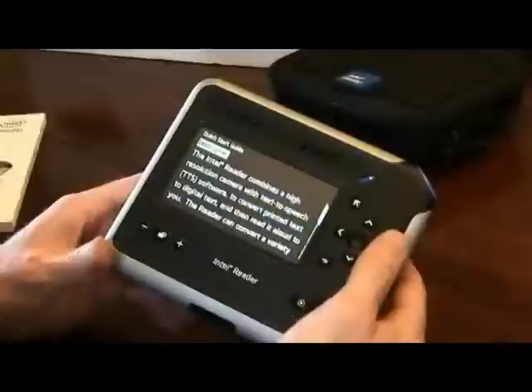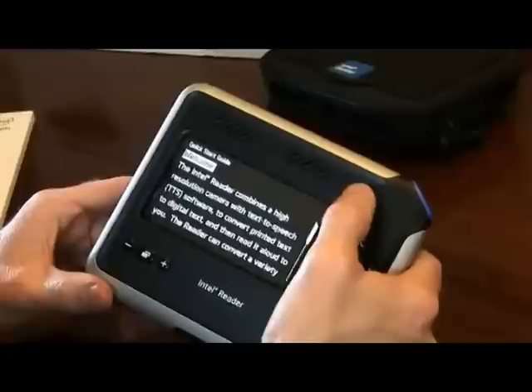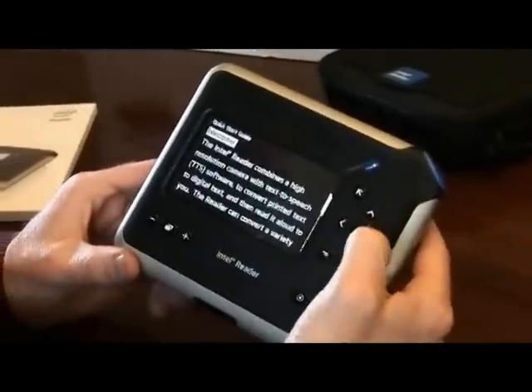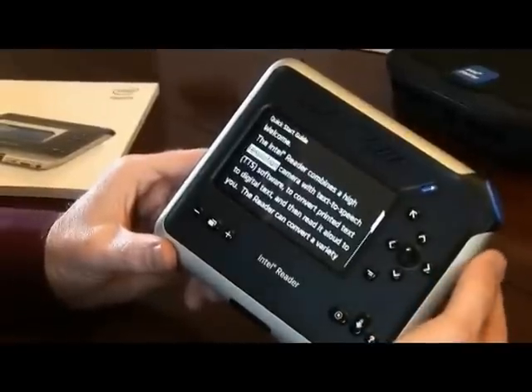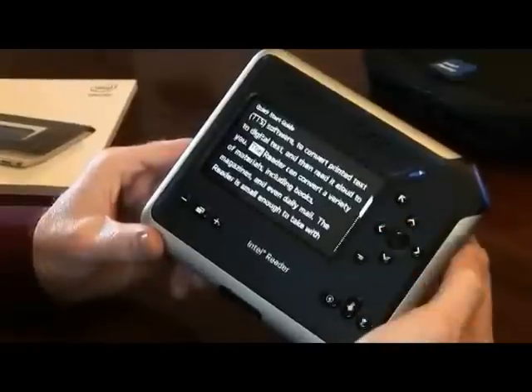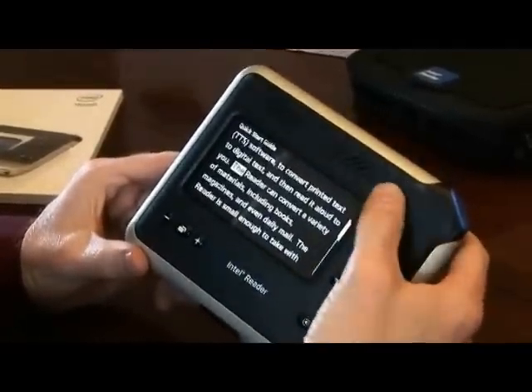So let's enter the help menu. You should start on the word welcome. To read, you either press the play button or the select button here. The Intel registered reader combines a high resolution camera. To pause, you press that center button again or the play pause button above it, the blue diagonal button.